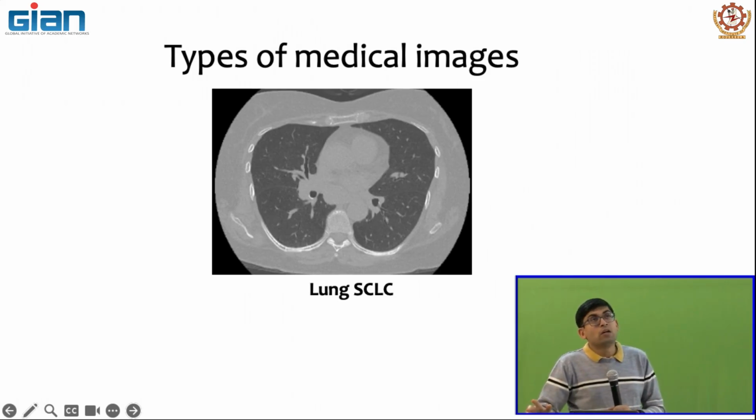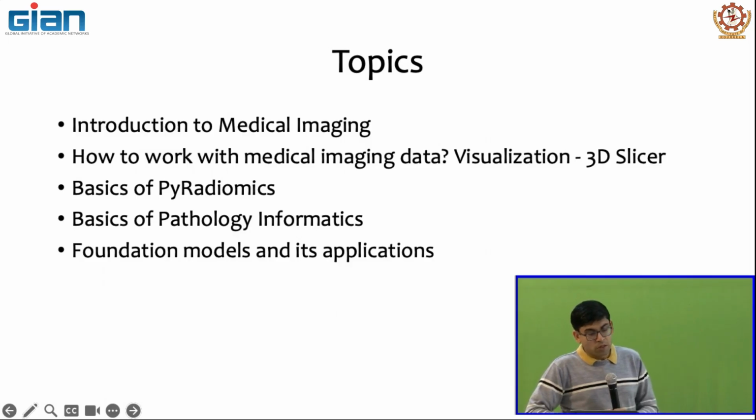In fact, you'll also learn about pyradiomics, what we had in the topic slide. Pyradiomics is essentially a library that you can use to extract radiomic features. It has a bunch of radiomic features. It's sort of a wrapper that you can use to call the functions to extract these different kinds of features. We won't really cover a lot of classification examples today, so those we'll keep for tomorrow. But you'll see how to invoke the pre-trained weights and all of that for many different things, along with the foundation models.